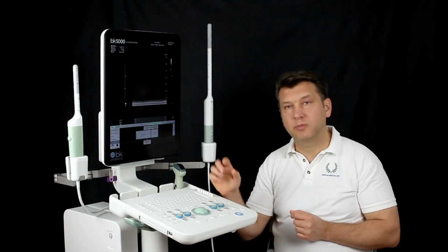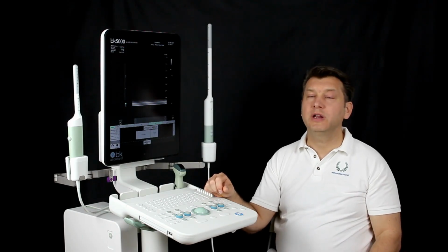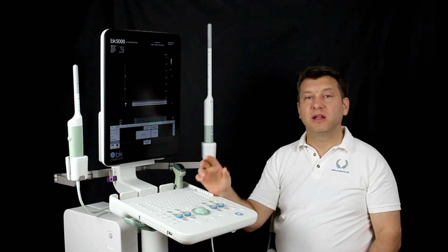It requires a little practice. However, after a short period of time you will become more independent and can conduct fast and well-founded pelvic floor diagnostics.